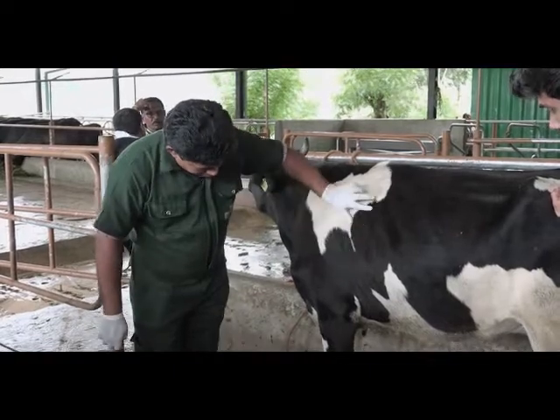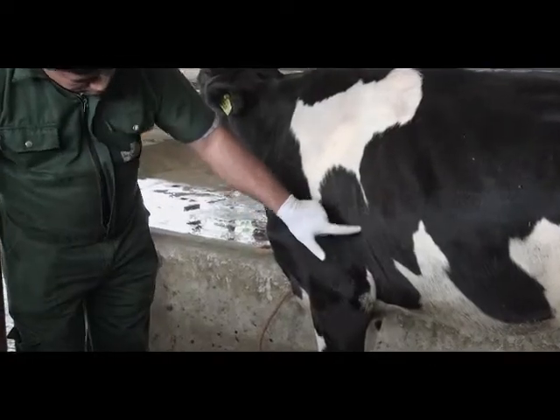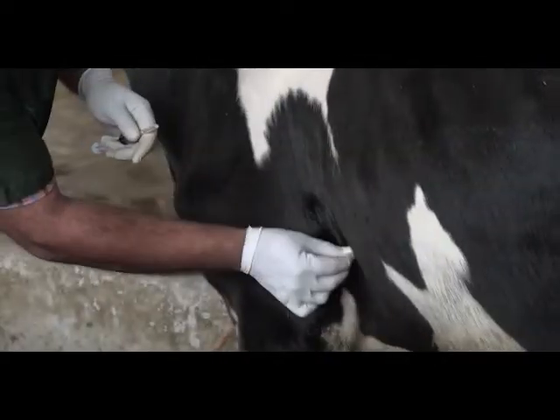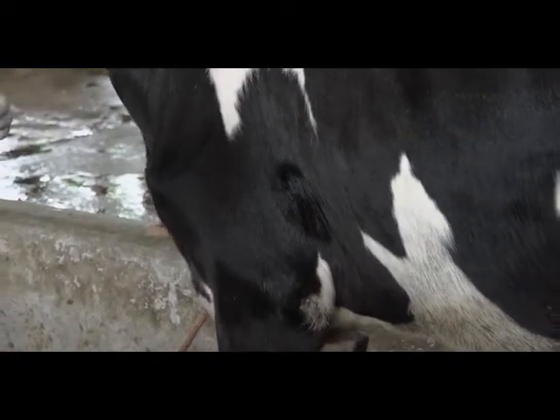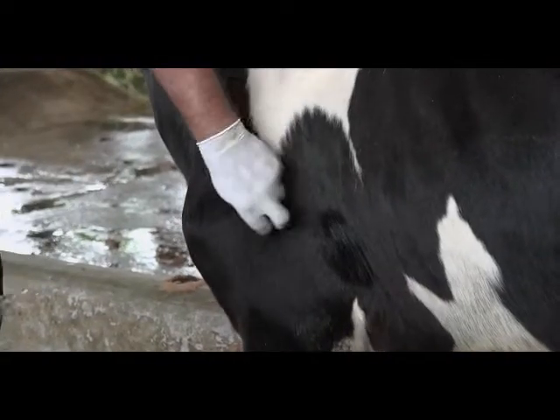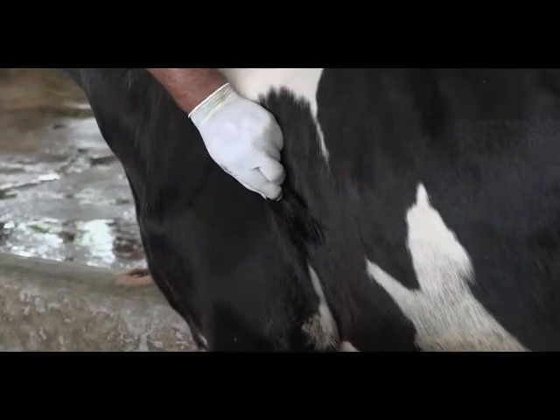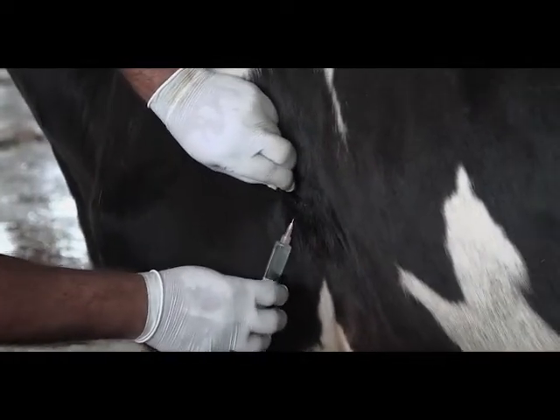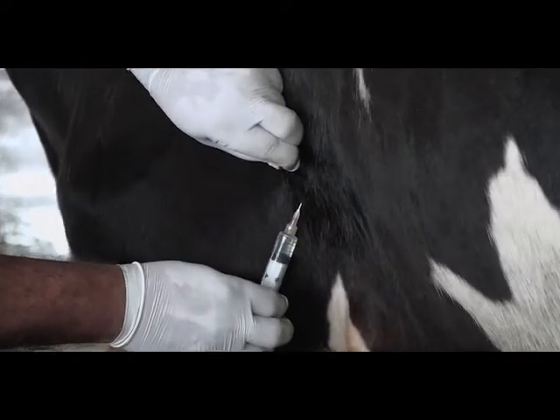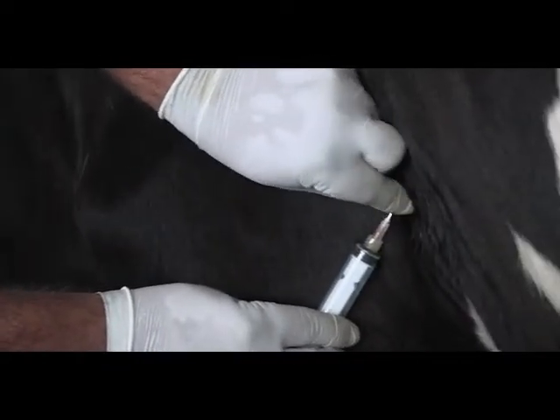Similarly, the subcutaneous injection can be given at the axillary region as demonstrated. First, the site would be disinfected in a concentric manner from the center to the periphery. Grab the skin to make a skin tent and insert the needle into the subcutaneous space inside the tent as demonstrated. Based on your preference, you can make either a skin fold or a skin tent in any of the locations while administering a subcutaneous injection.